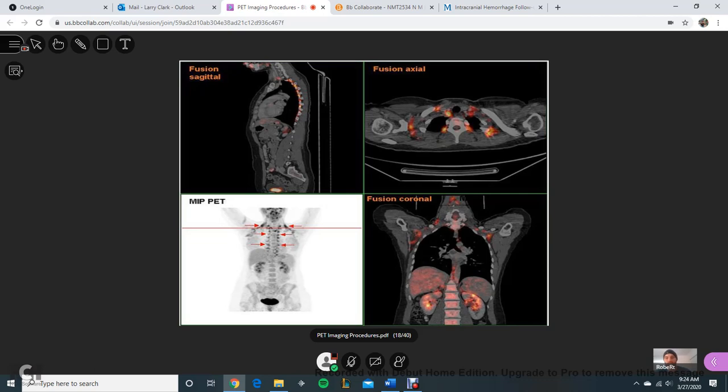So are we just going to assume that's always going to be fat, compared to some type of cancer? You have to look at the diagnosis for the patient and what they're there for. So if they're doing a whole body for breast cancer, and the lesions are not on the bone, you see how they're kind of on the mediastinum, on the sides of the bone?